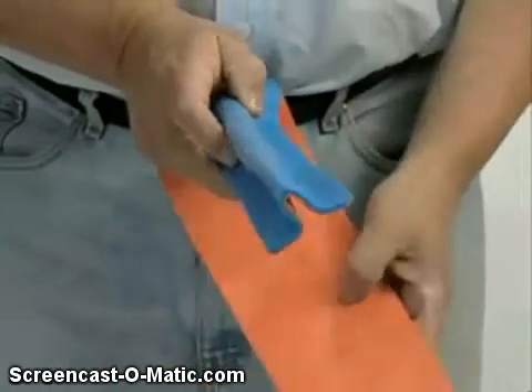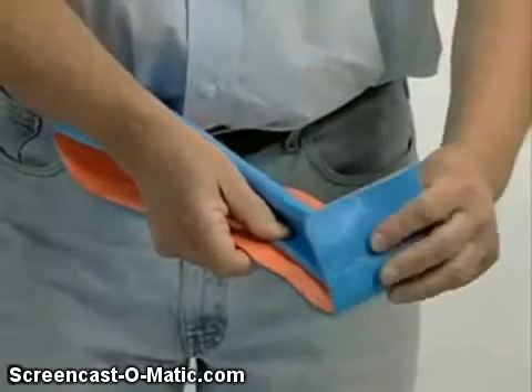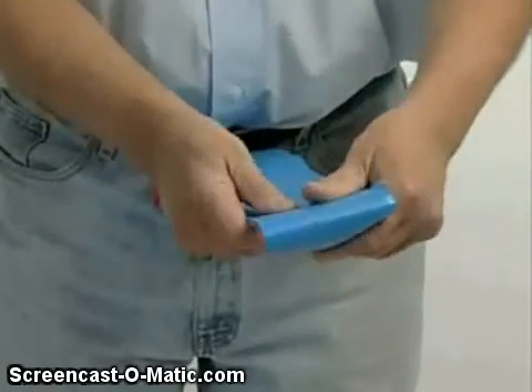Place this T-shaped beam as a support against the longer half of the splint and fold over the excess splint. This may be secured with tape.